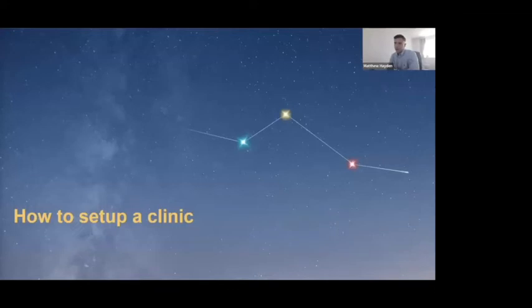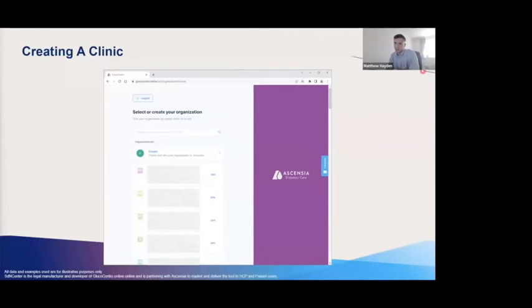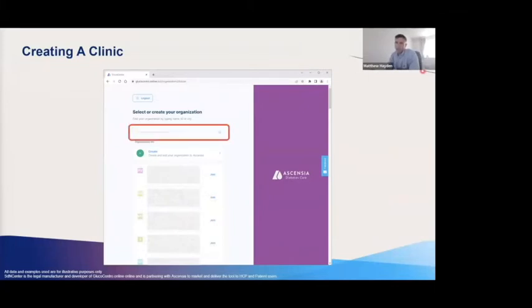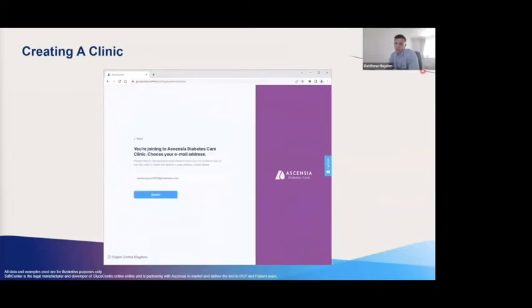Now that you are set up, you will need to either join an existing clinic if a fellow healthcare professional has already created one, or create a new clinic if you are the first. If a colleague has already created the clinic, all you have to do is find it from the list of clinics shown and click request to join. There is also a search bar facility if you can't find the clinic. Once found, you confirm your email address and the clinic administrator receives a notification and will then approve your request. Once approved, you are part of the clinic and can access all the people with diabetes linked to it.